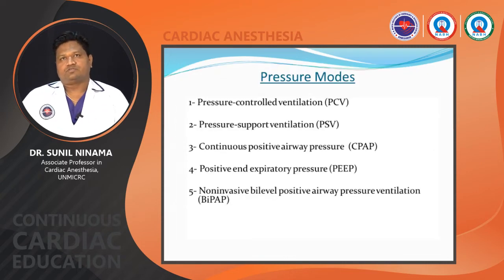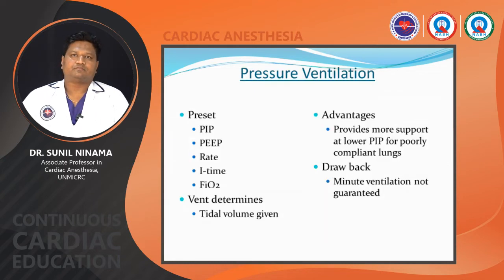These are the pressure modes now. The pressure modes are pressure control ventilation, pressure support ventilation, continuous positive airway pressure, positive end expiratory pressure, and non-invasive BiPAP. What do you mean by BiPAP? It is bi-level positive airway pressure ventilation.